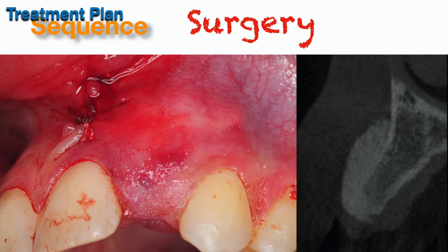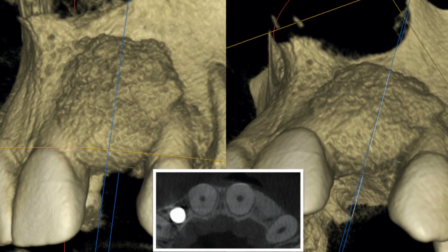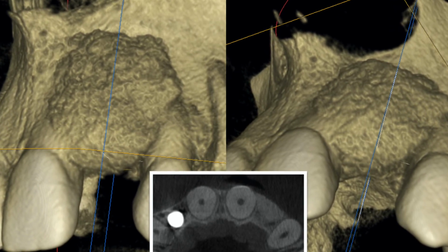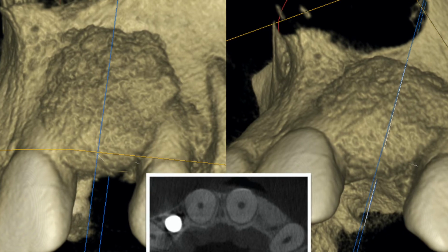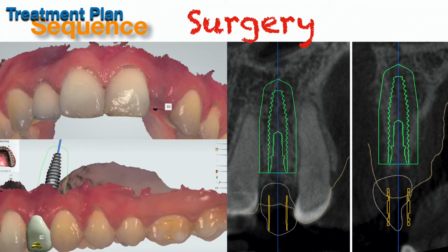This is a technique called a smart graft, which is basically a tunnel technique using vertical incisions on either side, which certainly resulted in a fairly good outcome in terms of bone initially. But some of this bone will resolve. This is the initial presentation. We have a good amount of bone augmentation, and certainly what we want to see. Over the next 4 to 6 months as it heals, it does undergo some shrinkage. We expect that.